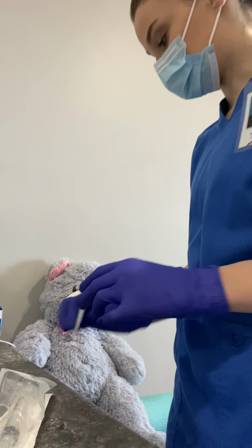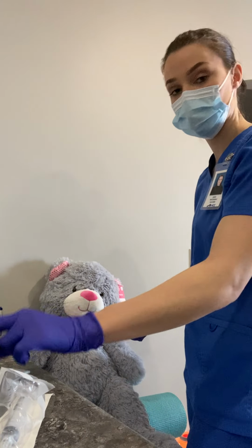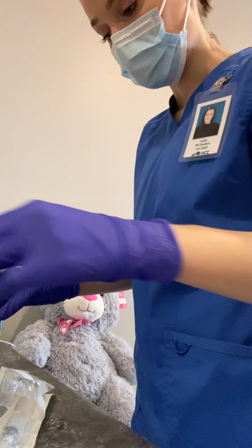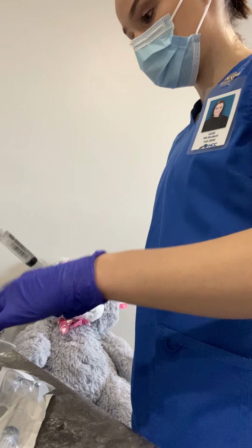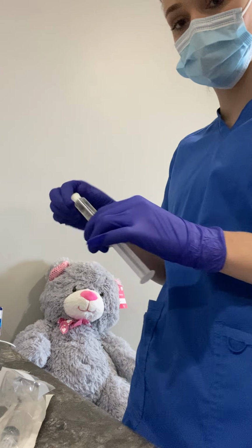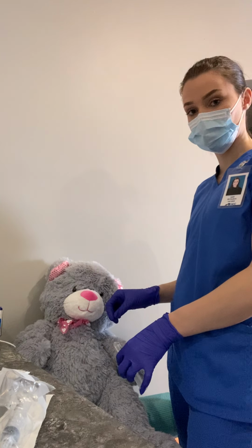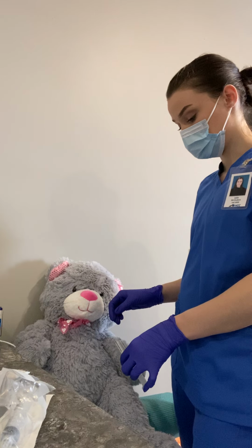Okay, so I'm going to take this and scrub her hub, maybe 30 seconds, get it nice and clean. I'm going to place my normal saline and flush with 5 milliliters, make sure we got that all nice and done.